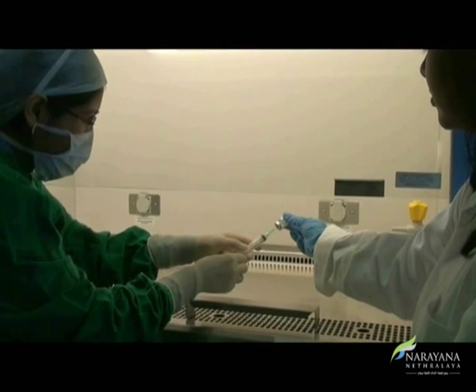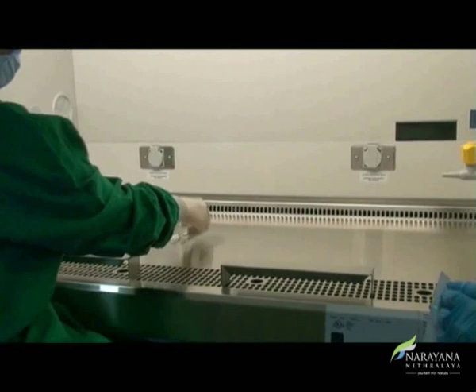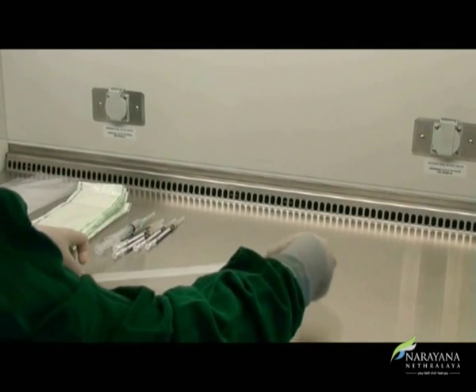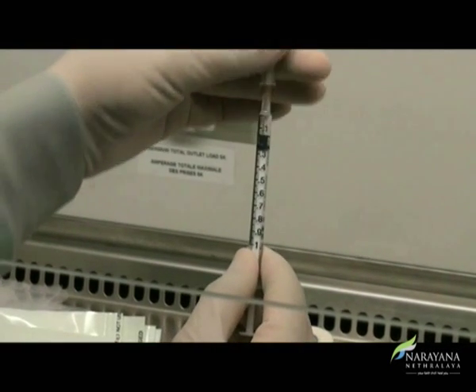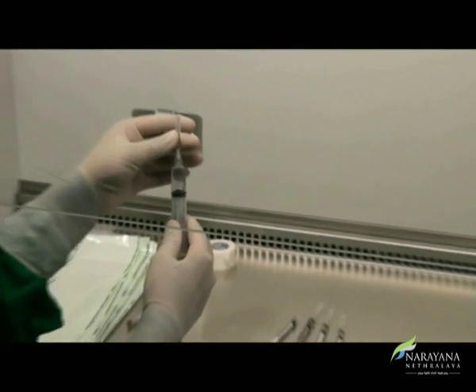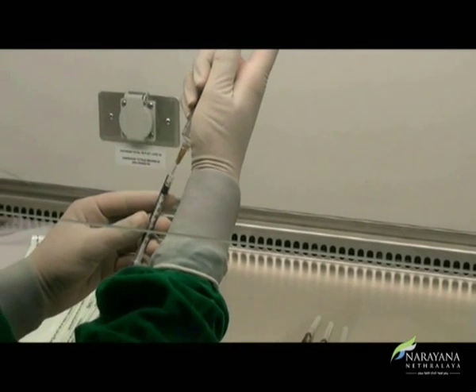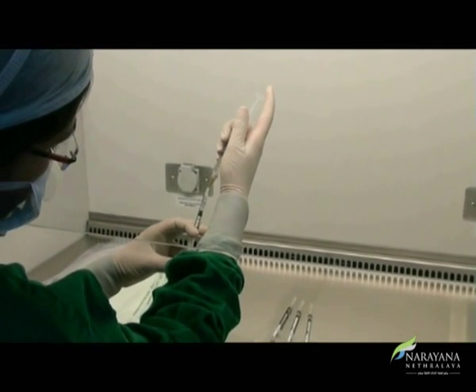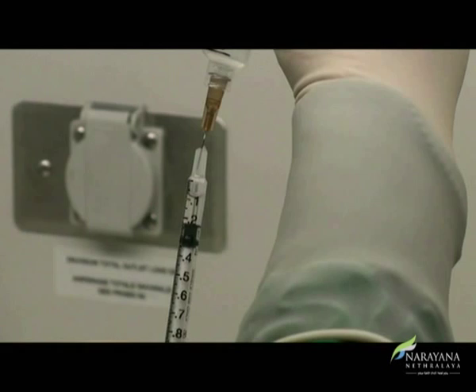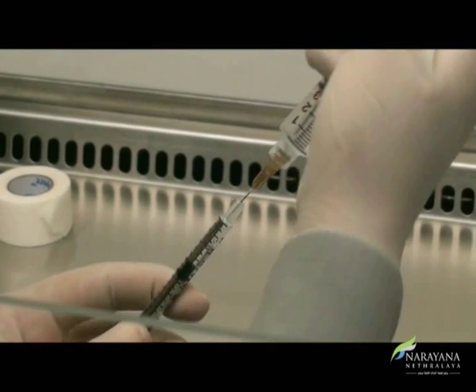Loading of the drug in a 10cc syringe should be done in front of the HEPA filter, preferably inside the hood. It is placed with cover on. After changing the needle, 1cc syringes are opened from the back and placed with the plunger at the 0.15cc mark. While pulling the plunger, the syringe should be in front of the HEPA filter with no obstacle in between, and the same is done at the time of each subsequent step. The syringe is filled to the desired level, then the plunger is pulled back a bit to prevent inadvertent push and spillover of the drug. The same is repeated with all syringes.